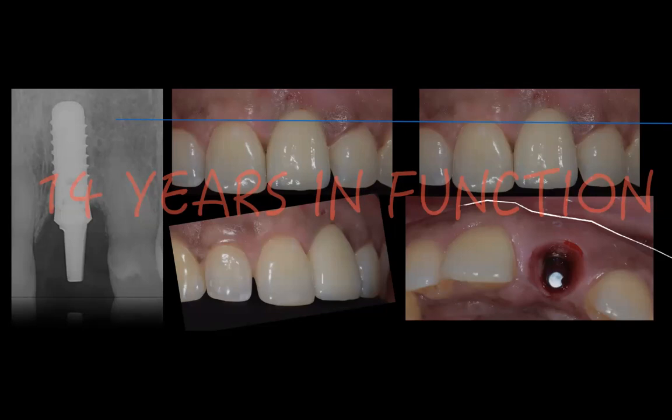So you could see that the bone has held up pretty nicely around the implant. The tissue is very, very healthy. You could take a look and see the zenith of the tissue up here is pretty nice. There's no collapsing of any sort in this area. Maybe slightly, but not that much. But now take a look in here. Take a look and see what happened here.